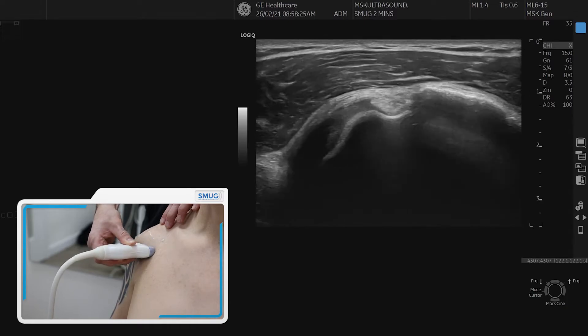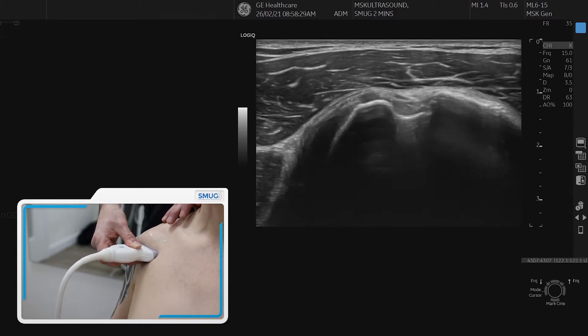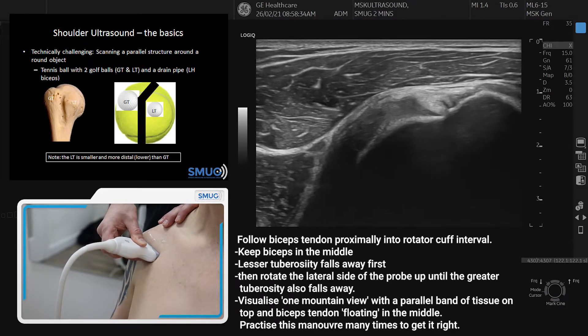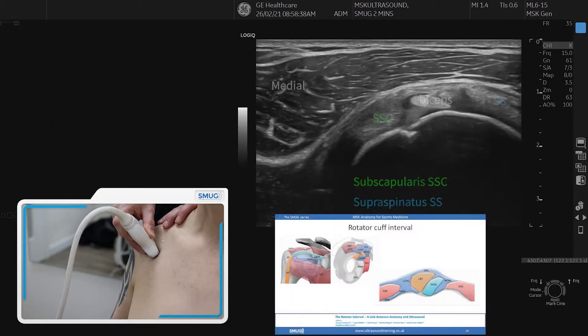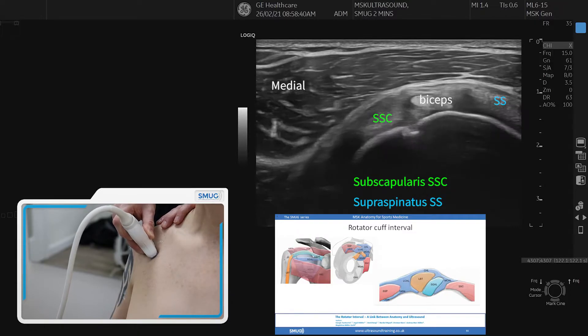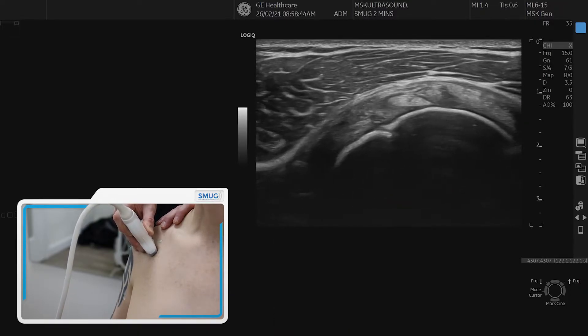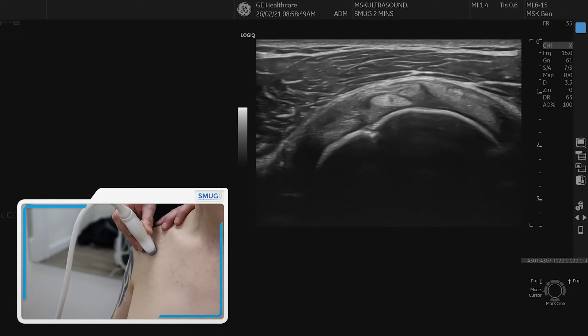Then we go back to transverse, line it up again — the lesser and greater tuberosity — and go straight up. The lesser tuberosity falls away, then turn your probe so the greater tuberosity also falls away, come up and over and then you're in the rotator cuff interval. It's a parallel band of tissue with the biceps in the middle floating in that soft tissue. On the left side of the biceps is the subscapularis, on the lateral side is the supraspinatus.